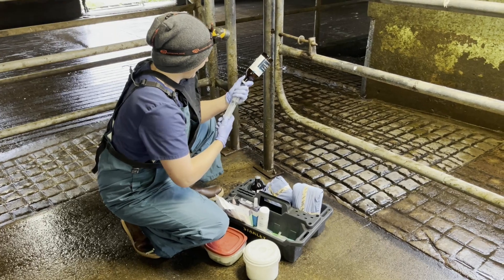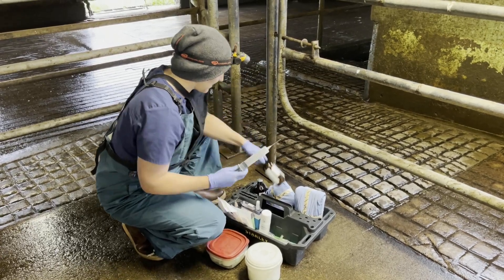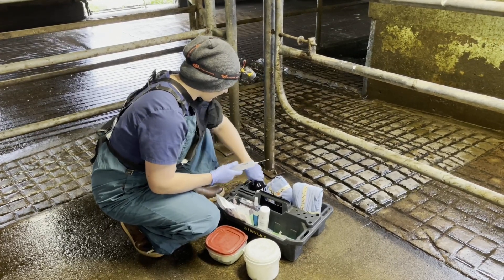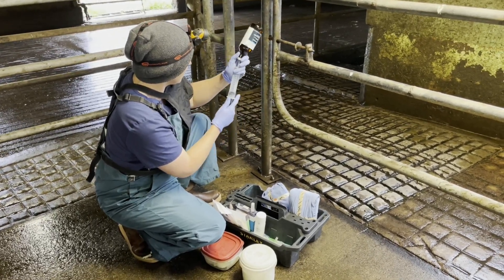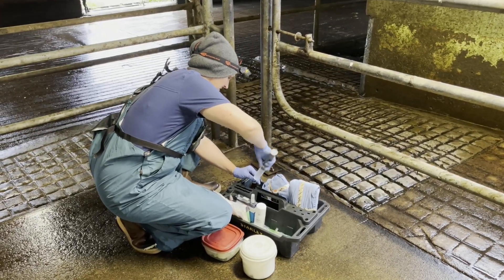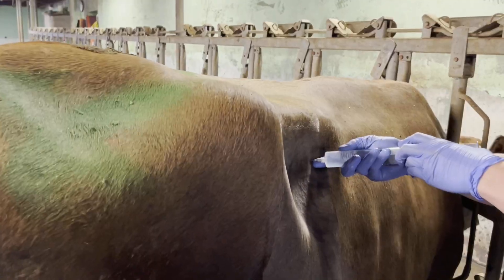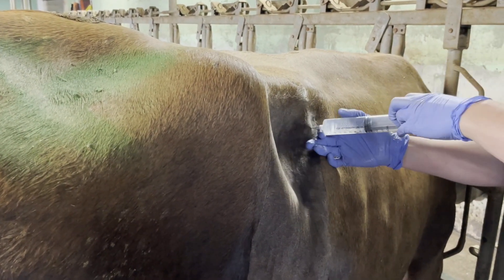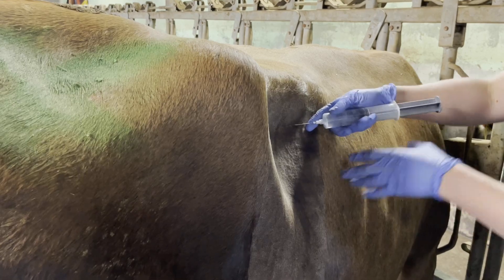That's a big old syringe and needle. So I'm doing lidocaine — this will be our local anesthetic for the cow. I do a reverse inverted L block for the skin and the muscle so that she's not going to feel my incision. I start up here because all the nerves are coming out of the spine and coming in this direction, so we block them here so they can't get to the surgery site.